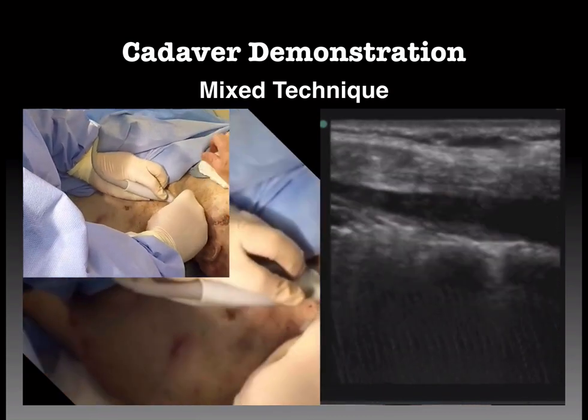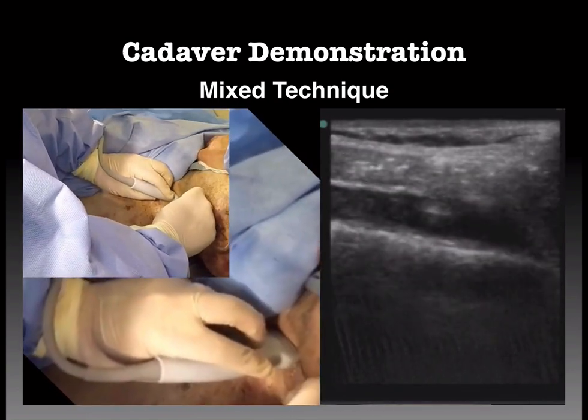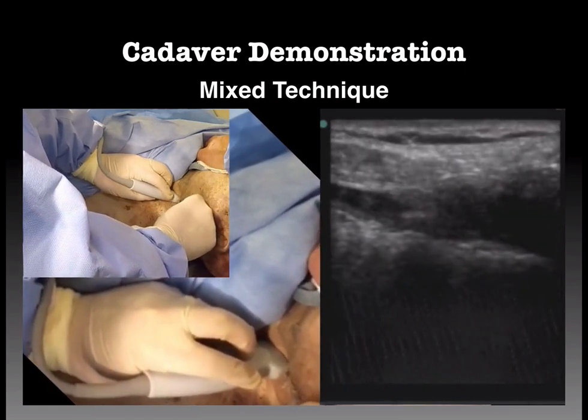So we can turn and find our needle in long axis. We're scanning for it. We're scanning for the needle. Once we find the needle in long axis, then we can advance our needle and not go out the back wall. This is a perfect rescue technique.